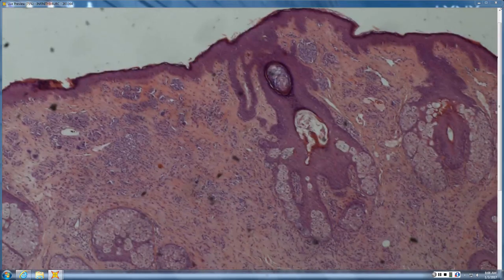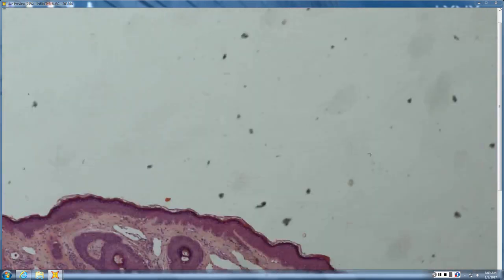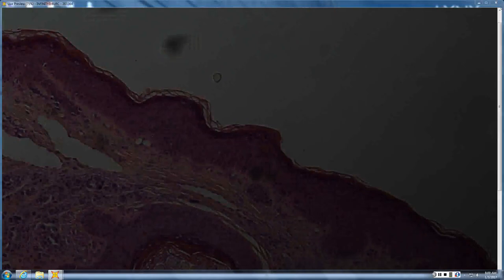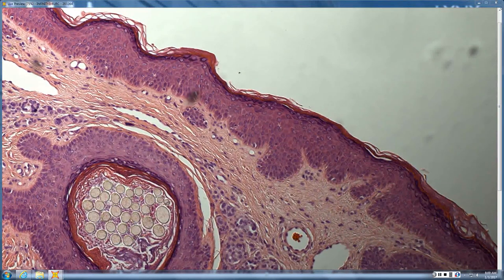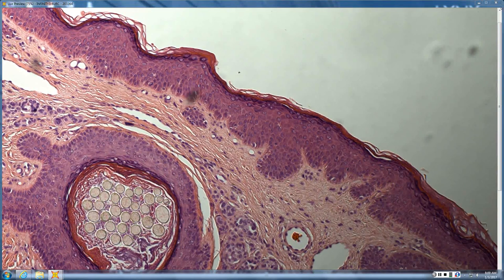Okay, so we're looking at a nevus. And what's going on incidentally in that nevus? I'll actually flip the condenser down because I think it's easier to see. Is that a worm or suture or what is that? Sure. I should know that, but I don't. So anyone, all those little bundled vellus hairs goes with? It's not like an eruptive vellus hair cyst, is it?